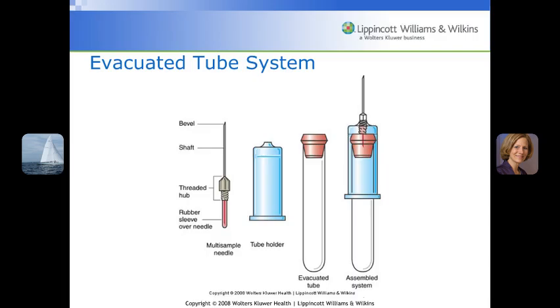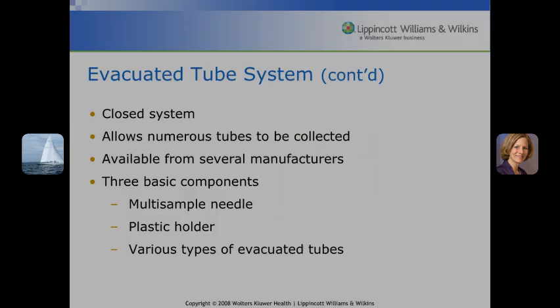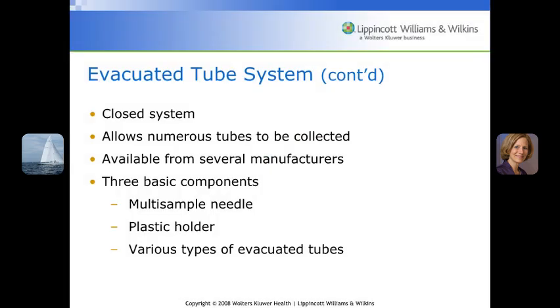So here's an example of your evacuated tube system, the closed evacuated tube system. This is a closed system, so you can collect numerous tubes, which you already saw in class. All different kinds of manufacturers make it, but you've got your three basic components: your multi-sample needle, the plastic holder or hub, and then different types of evacuated tubes.